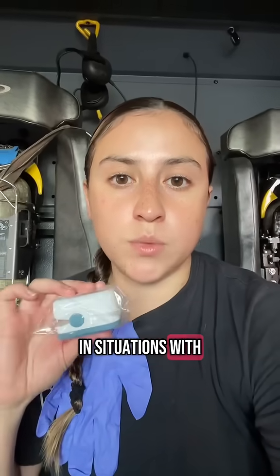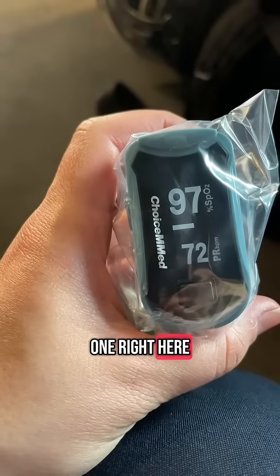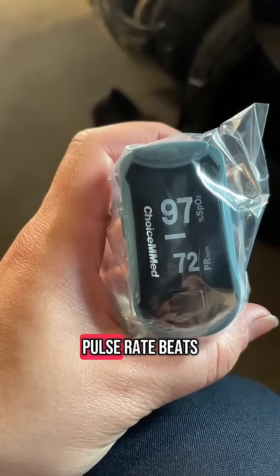You might use this in situations with asthma, pneumonia, respiratory distress, things like that. As you can see with this one right here, there are two numbers. The top number is your SpO2 number, and the bottom number is your pulse rate in beats per minute.